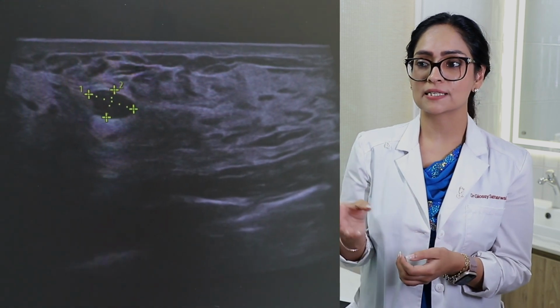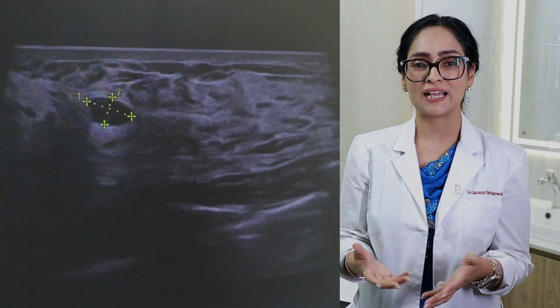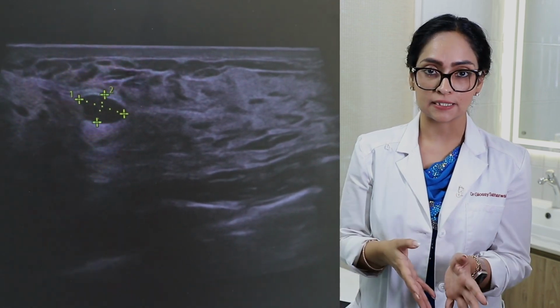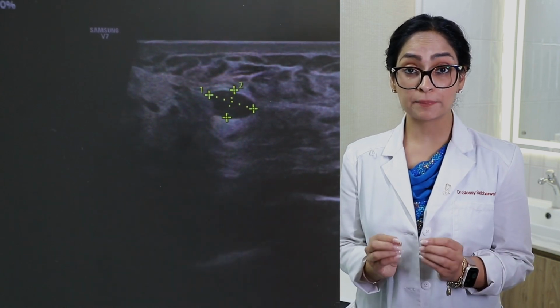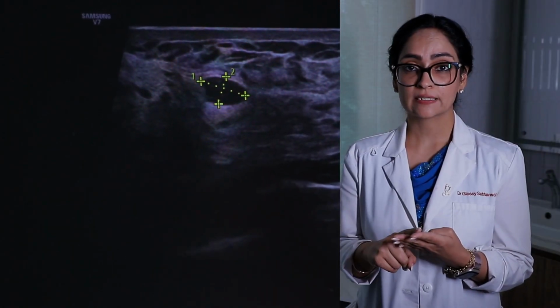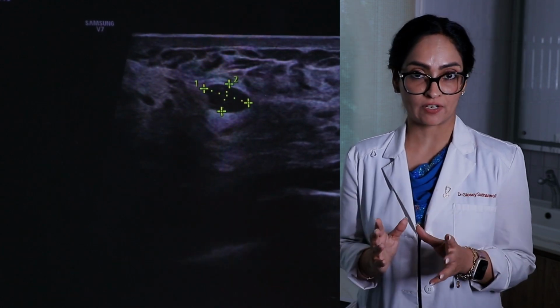The commonest breast masses that we see. They are benign, they keep changing their position, they are mobile, they are not fixed in the breast parenchyma, and that is how we differentiate them from other conditions. So how does a fibroadenoma look like? A typical fibroadenoma is well defined, hypoechoic, solid mass lesion with minimal peripheral vascularity, or sometimes no peripheral vascularity is seen.